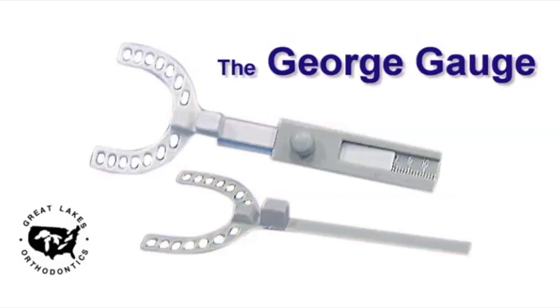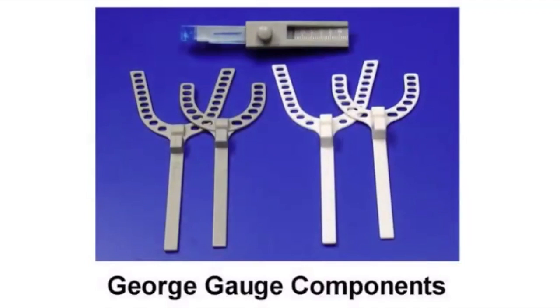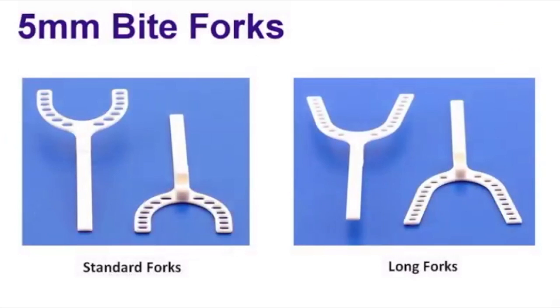The George Gauge allows the clinician to capture the protrusive bite registration. It will also enable you to have a baseline so you know where your start position is with your sleep devices. The George Gauge comes with two sets of sizes. The white fork will indicate the 5mm incisal clearance once placed in the gauge, and this is the one that is more commonly recommended for your sleep devices.